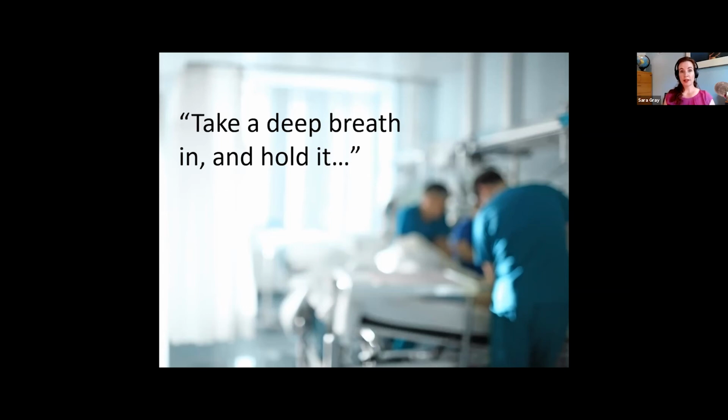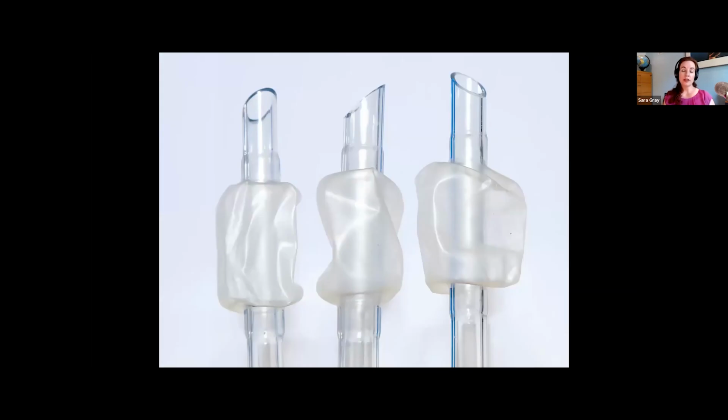So you want to be sure they can take that deep breath, they're holding their breath, and then you're going to deflate the cuff with a 10 cc syringe and pull the tube out. Really easy.